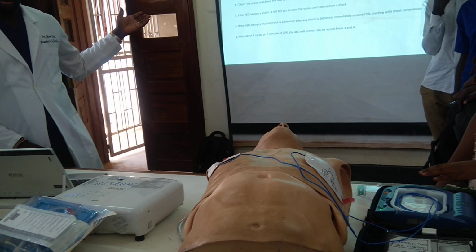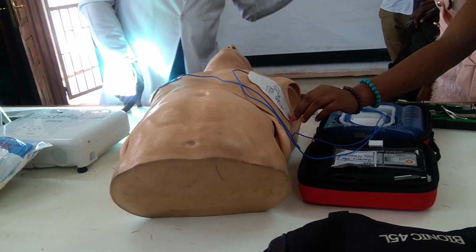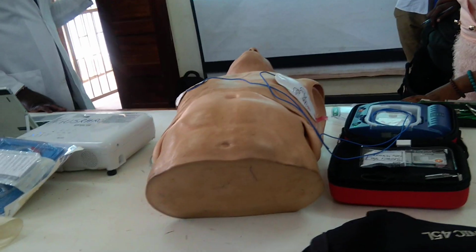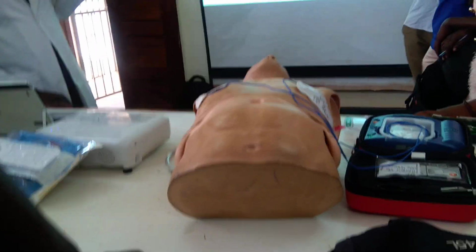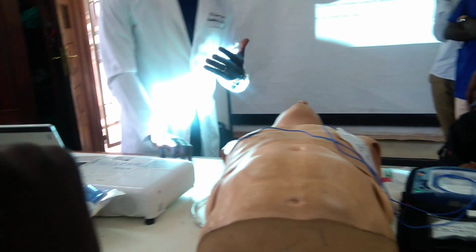I think we have removed it. It must not be touching clothing or each other. Then after that, when it is analyzing, it will tell you whether a shock is advisable or no shock.